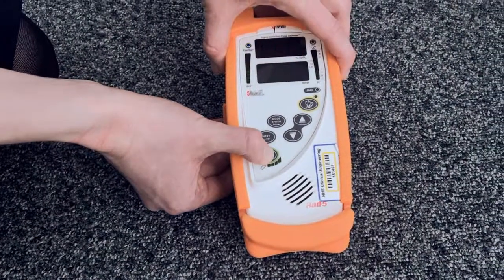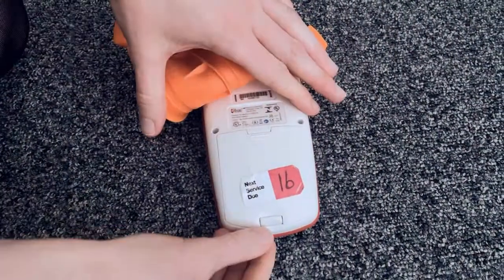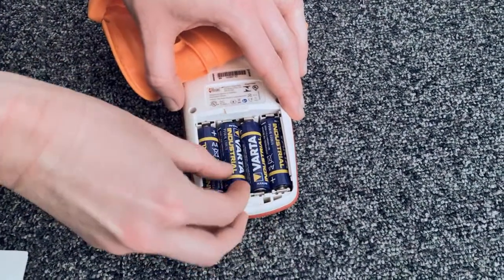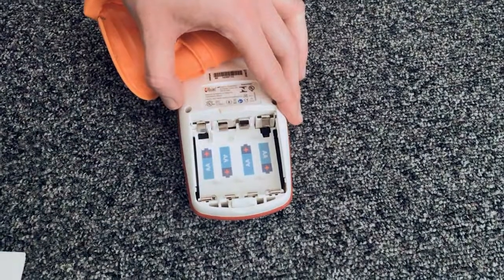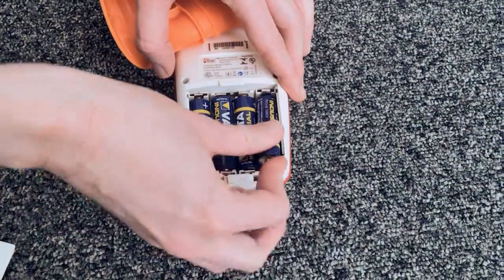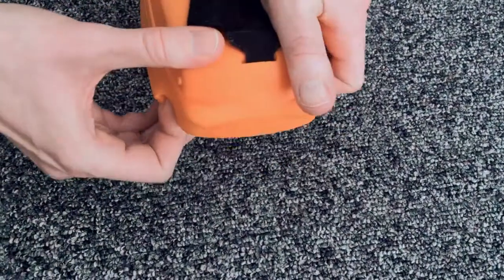To change the batteries, turn the monitor off, peel back the silicone cover and expose the back of the machine. Press down on the button at the bottom of the machine and pull the back of the monitor towards you. Remove the old batteries and dispose of them safely, then insert some new batteries. The machine tells you which direction to place the batteries in — make sure they are all firmly in place. Then gently slide the back of the monitor back on until it clicks into place, and reapply the silicone cover.